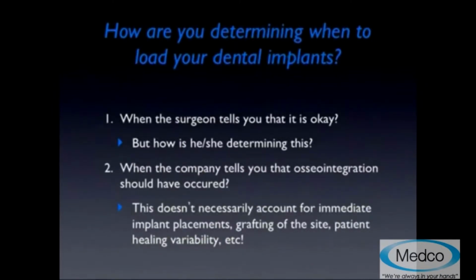implants? Because number one, if you're the surgeon or if you're a restorative dentist and you're waiting for the surgeon to tell you if it's okay, how are they determining it? What are they objectively doing to determine it's okay? If you're waiting and determining it based upon what the company tells you that osseointegration would have occurred, well, that doesn't necessarily account for extenuating circumstances such as if it was an immediately placed implant, if the site was grafted, if the patient had a variability to healing, etc. So not all sites are the same.